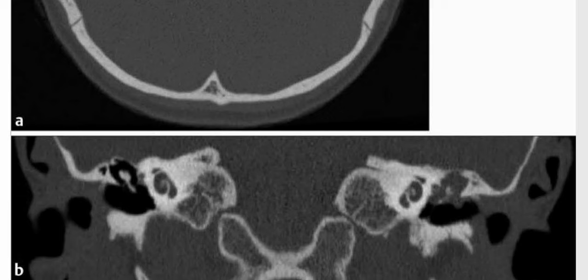Acquired cholesteatoma originates in Prussak's space and causes blunting of the scutum and ossicular erosion. In the differentials, you can add a normal variant vasculature like aberrant internal carotid artery, cholesterol granuloma, and glomus tympanicum. This is a diagnosed case of acquired cholesteatoma.